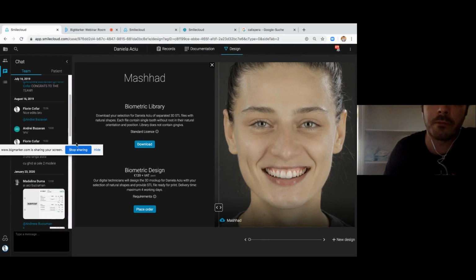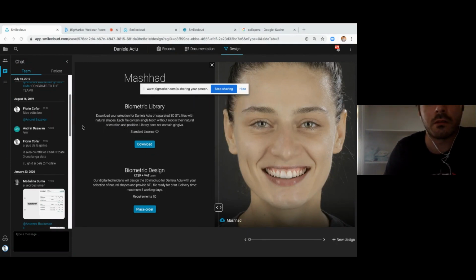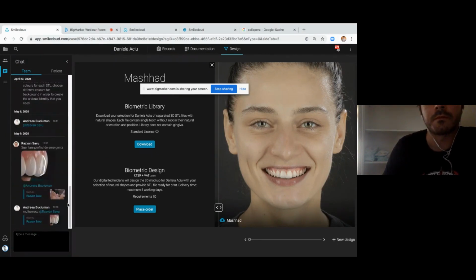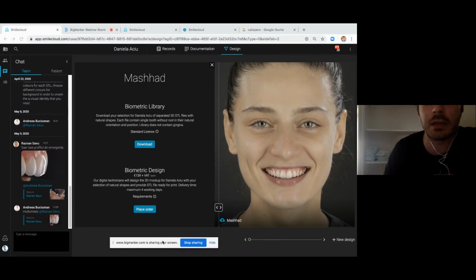Okay, that's good. Theodora, I think we had your question answered, of how you can transfer everything directly without touching anything, and you just ask for a biometric design and you receive everything you did in 2D in 3D. So it's up to you what you would like to do. If you just want to be the dentist and don't want a headache, that's an option for that. But we're not enforcing that type of business. That's just one end of the stick for some people that are interested.